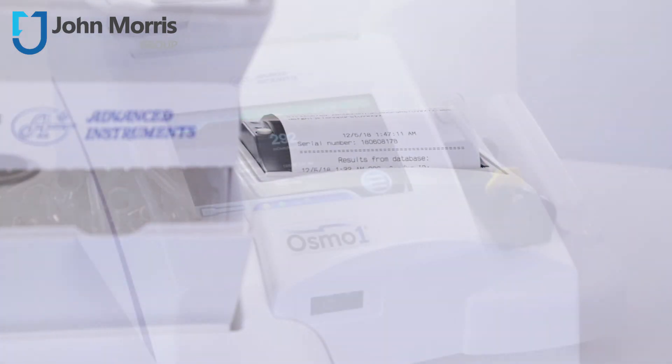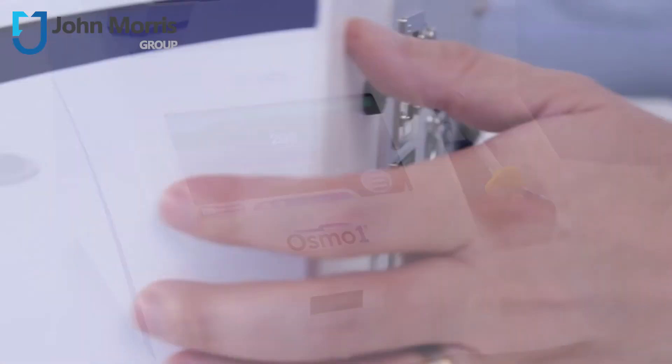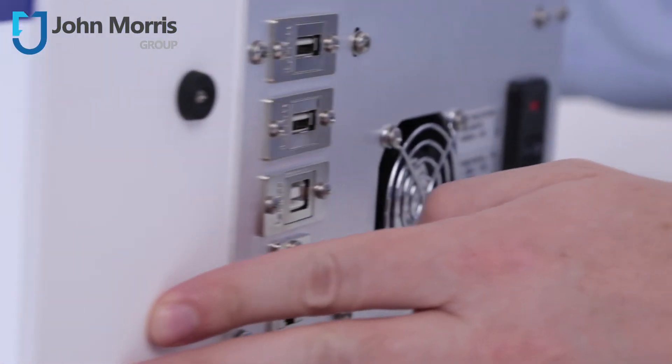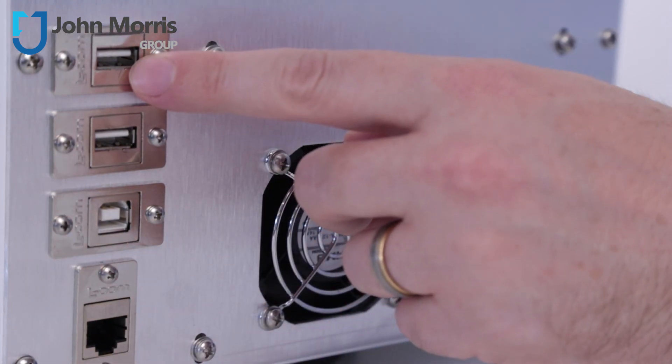292 on a reference standard of 290 — in a minute and six seconds, you won't even have a chance to make yourself a cup of coffee. Swinging the unit around, you can see here the LAN connection for the LIS, or you can download your data straight to a USB.